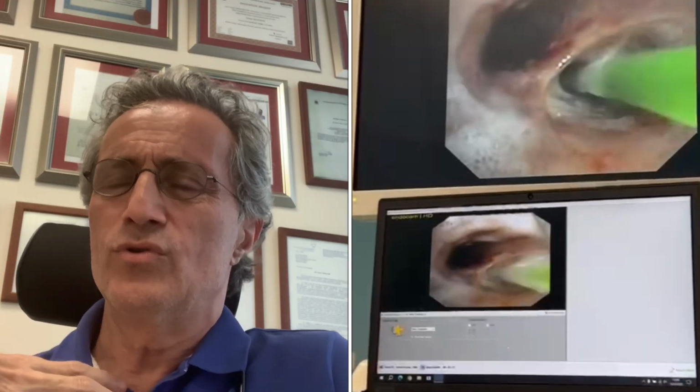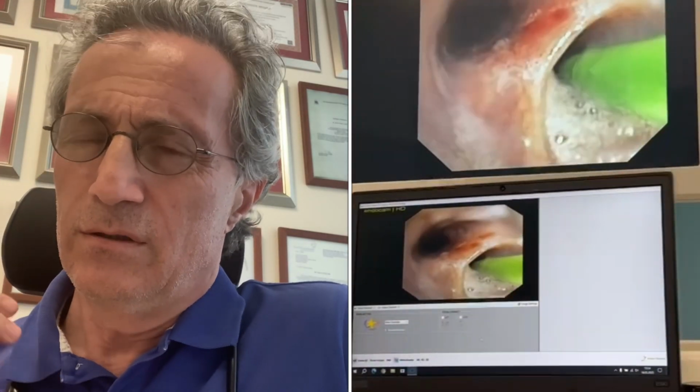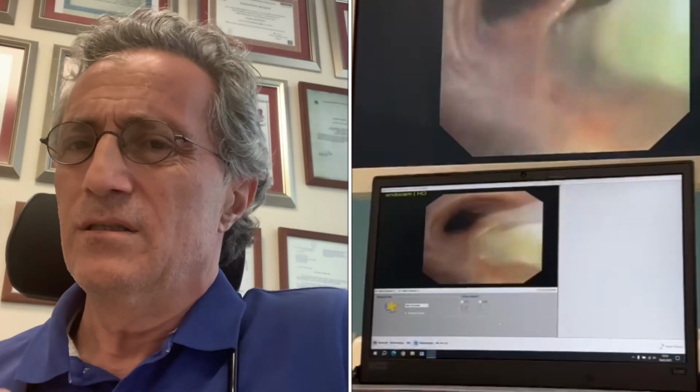The procedure, we can call it bronchial resection or bronchial wall scraping. The patient is intubated with a single lumen tube and put under general anesthesia. A flexible bronchoscope is used to clean the airways, aspirating thick phlegm, and bronchial lavage is sent for microbiological culture to determine appropriate antibiotics if any infection exists.